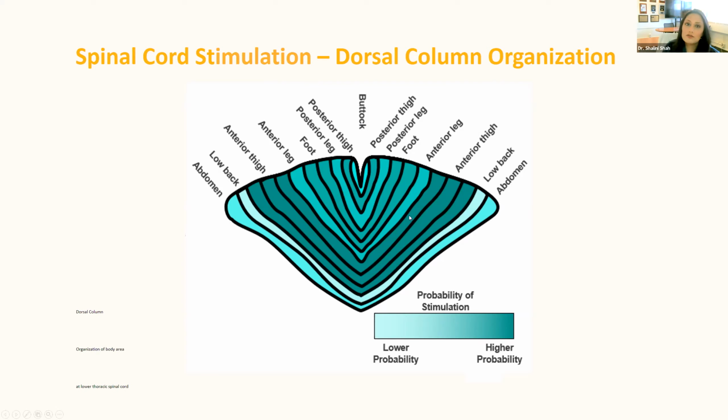Okay, so it's really important that you find an interventional pain physician who understands these layers and can put it in the right place. And remember that real estate in the back portion of the spinal cord is so tiny. So every millimeter matters. So it's really important where we put it so that we can capture the area of the pain.